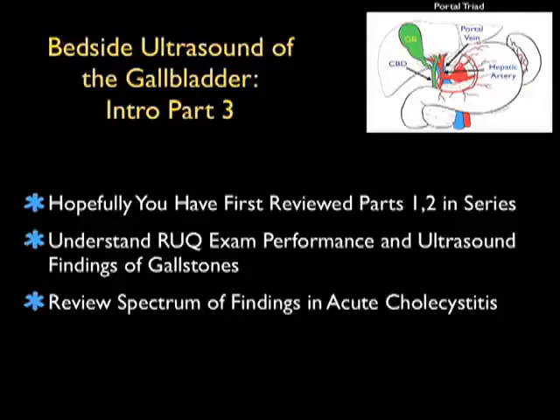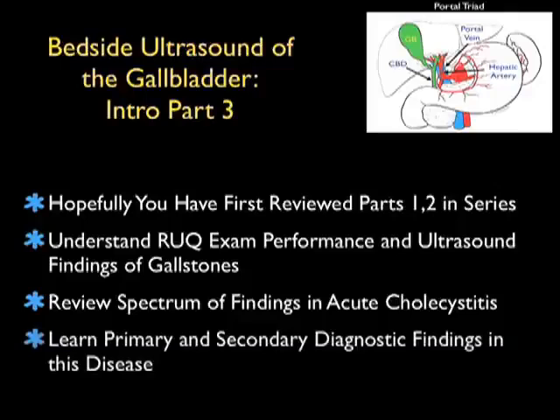In this module, part 3, we're going to specifically review the spectrum of findings found in acute cholecystitis, and we'll learn the primary and secondary diagnostic findings in this disease.